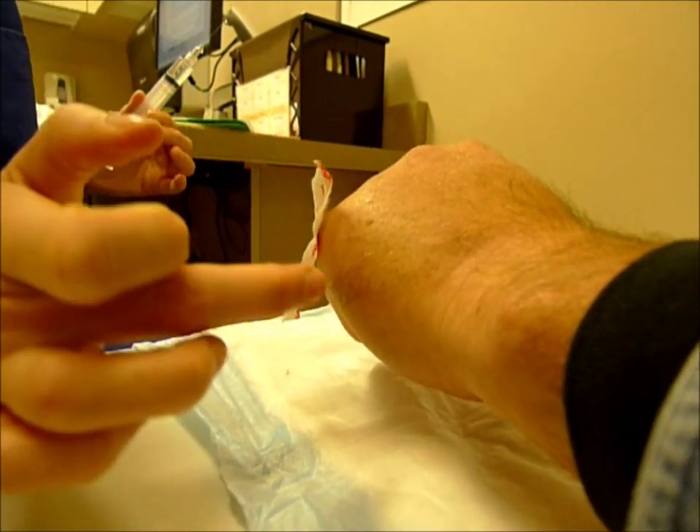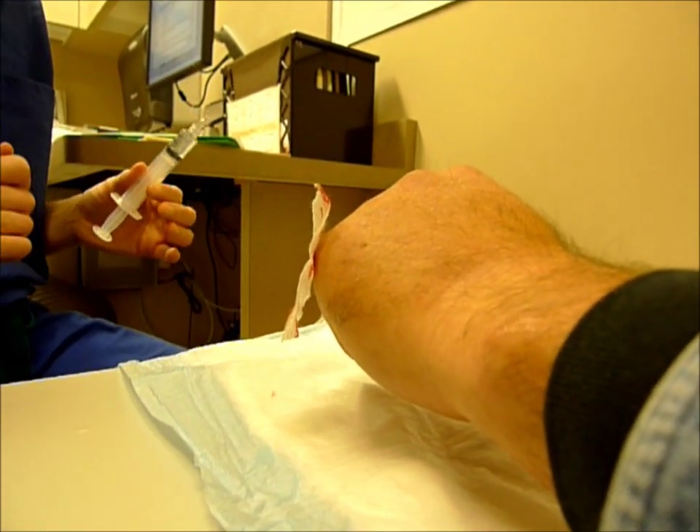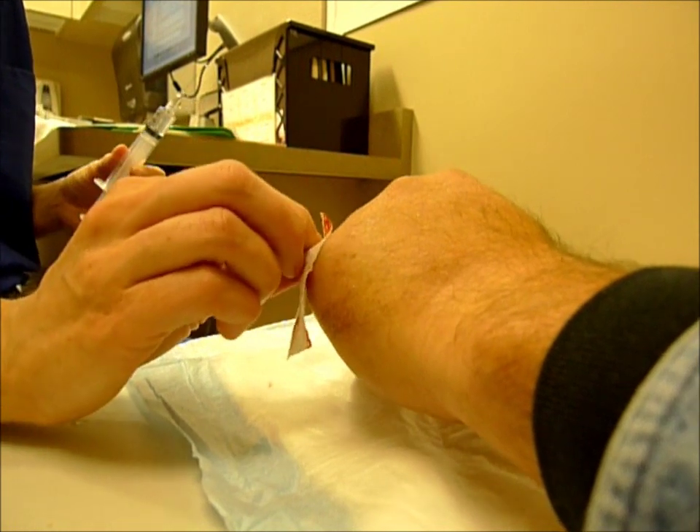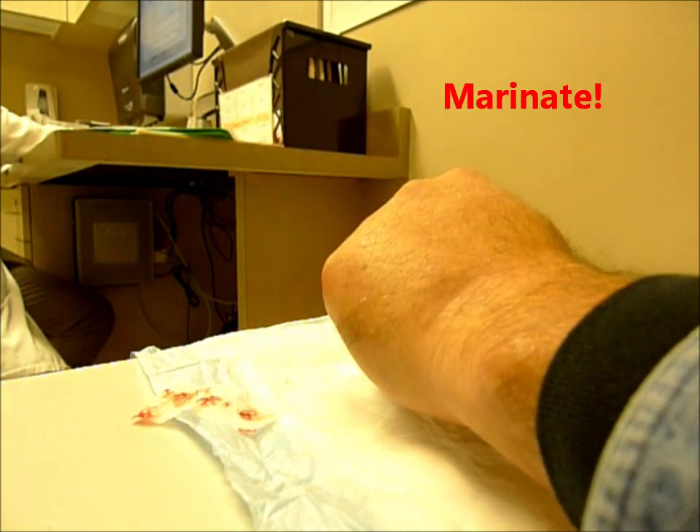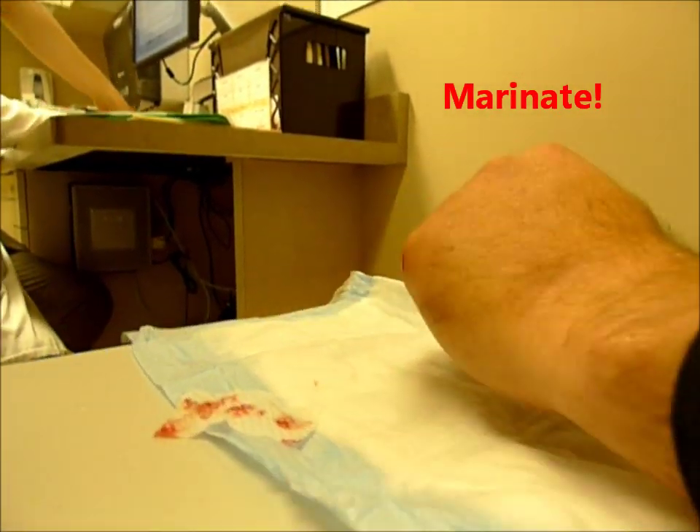So we put some numbness in and I think I got proximal enough to make sure. We've got to let this kind of marinate for a little bit, and we'll see how it does. We're going to let you marinate now — that's why it didn't go well. We're going to grill you.